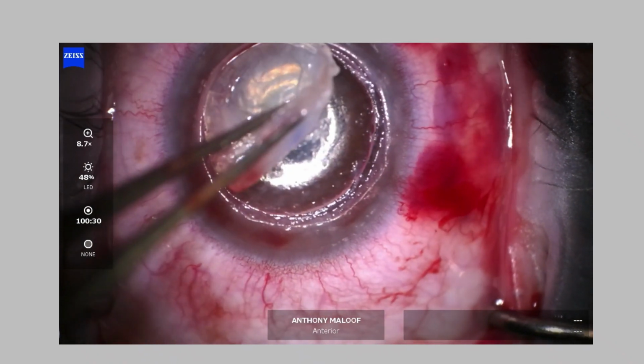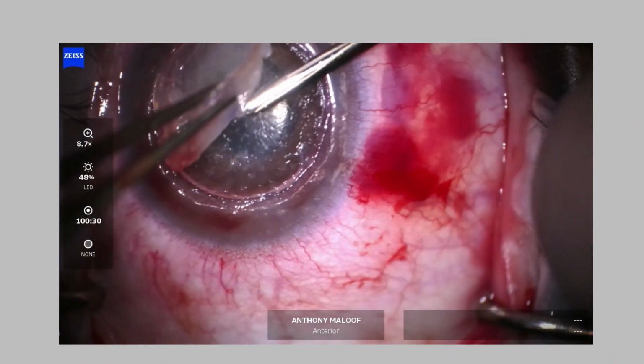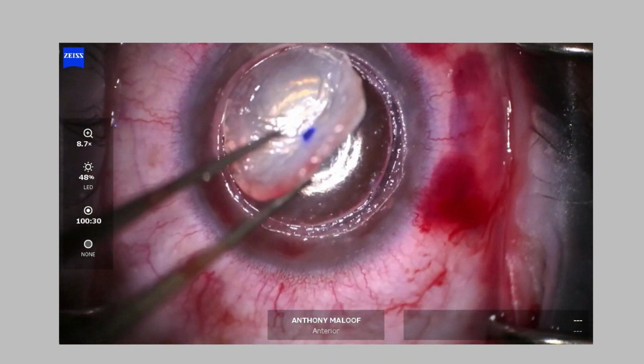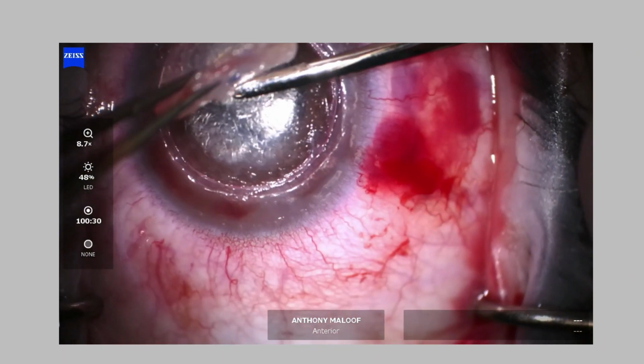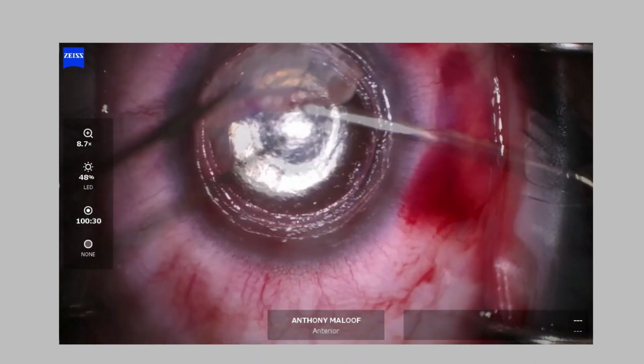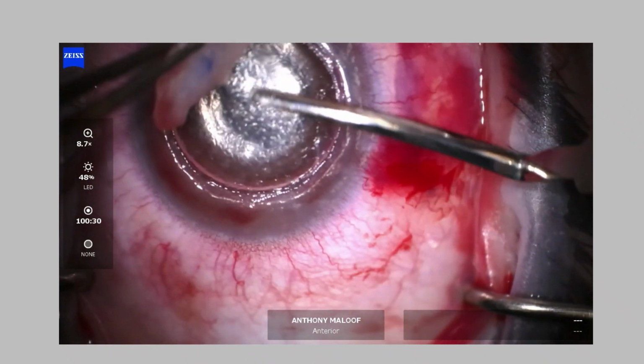Don't get too gung-ho because you'll rupture, and then in these cases ruptures usually don't move, but it's much harder to dissect once you've ruptured. It's much easier when you haven't. At this point you can go right out to the periphery and just remove it, and then proceed to a tidy up of the central zone.